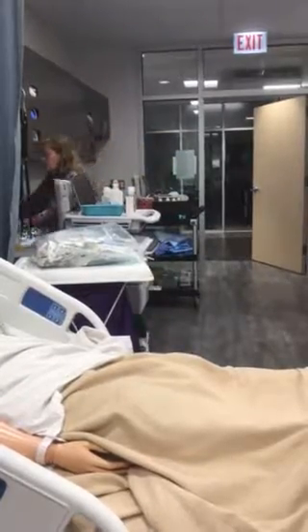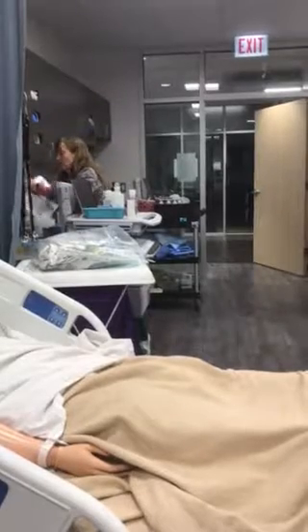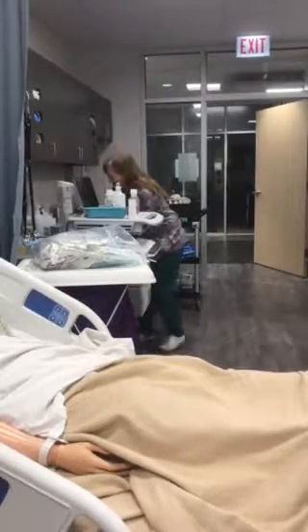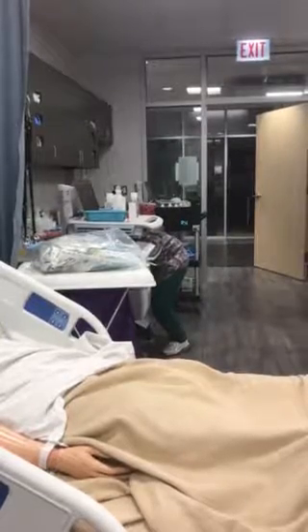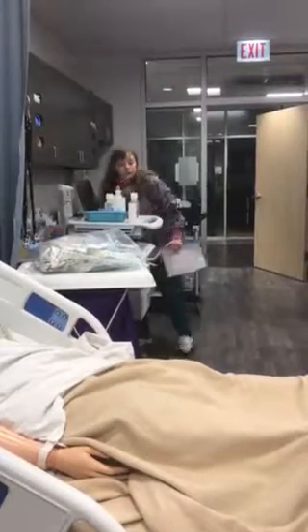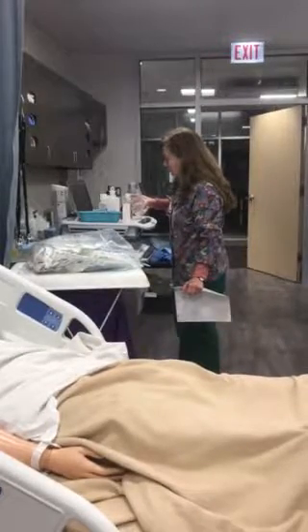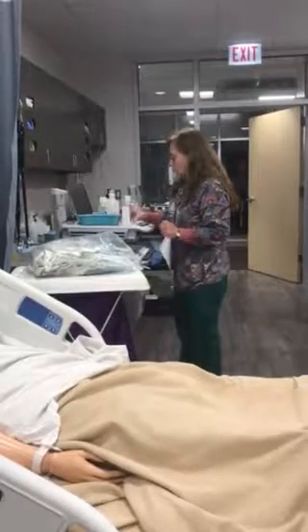500 milliliters in here. Probably won't use all 500, but if there becomes a problem. Alright, that's 500. So then what I would do is I'd go ahead and put extra water in here, anywhere between 20 and 30. So I've got this labeled, but I still want to prepare this medication.